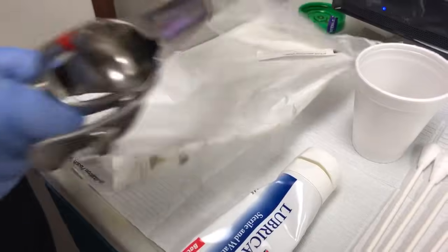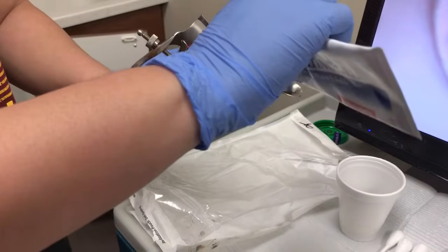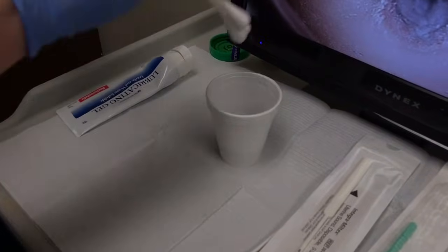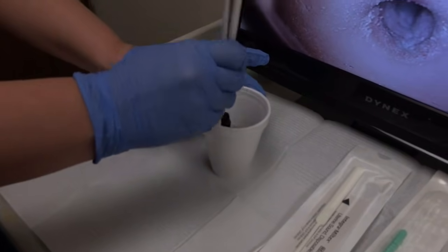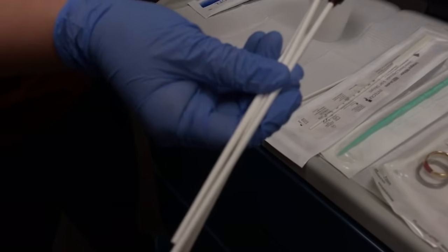The medical assistant would grab the metal speculum and place a drop of lubricant on it for the provider. The medical assistant will then take three OBGYN swabs, dip them into the betadine solution, and hand them off to the provider with the end towards the provider.